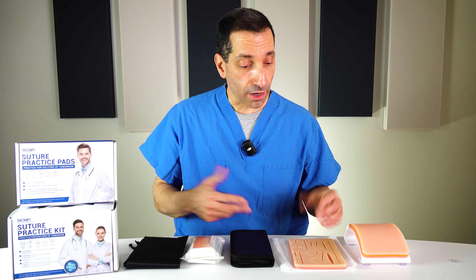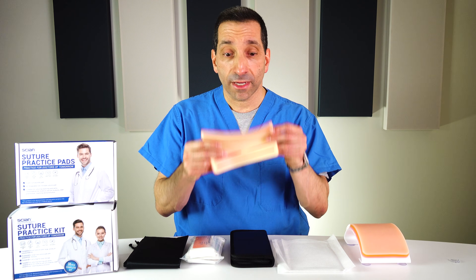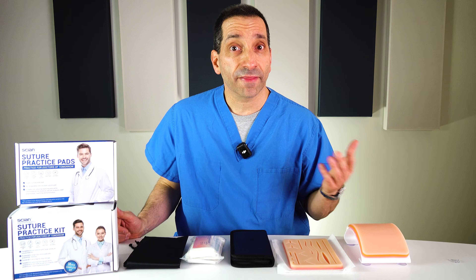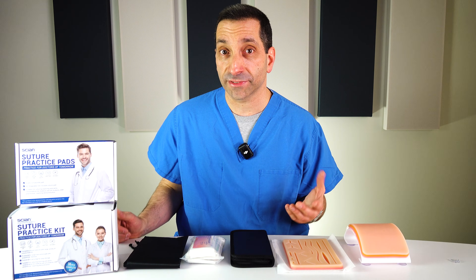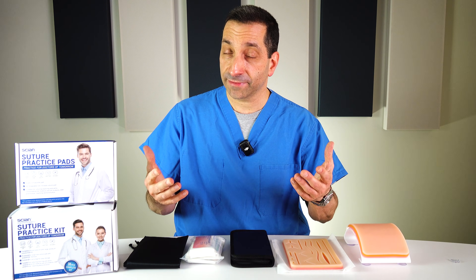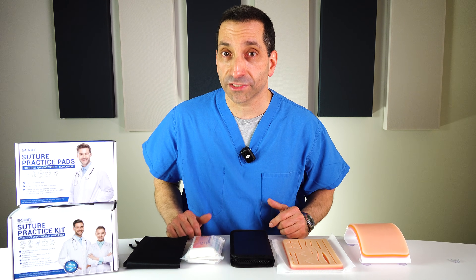But now in modern times, there are these suture pads that are out there that are as close to human skin as you can get. Human skin is actually going to be easier, but these are great for multiple situations — if you're in school, NP, PA, medical school, or even if you work in some austere medical environments away from hospital-type care and need to potentially do some suturing on your own. These can be practical for learning in many different situations.